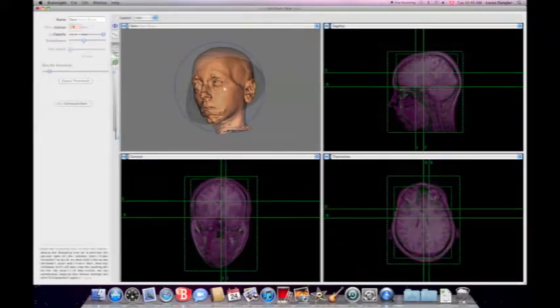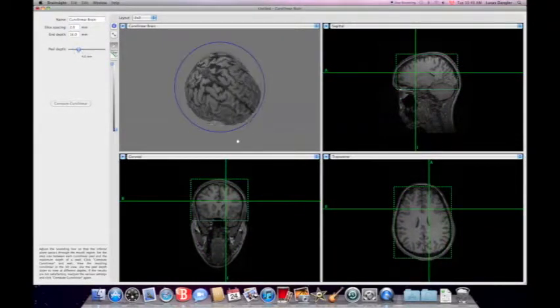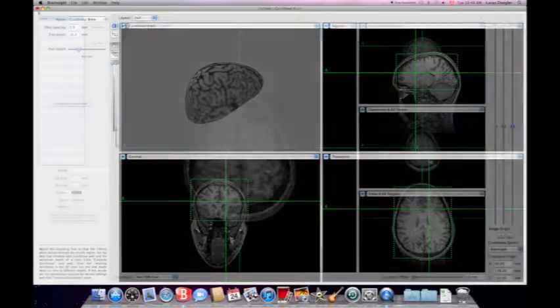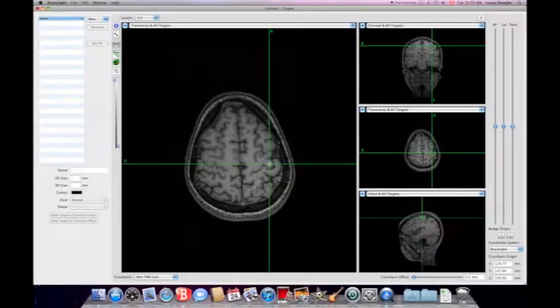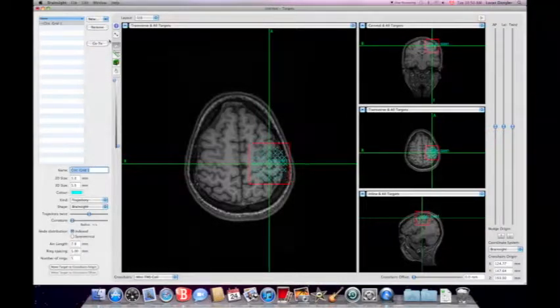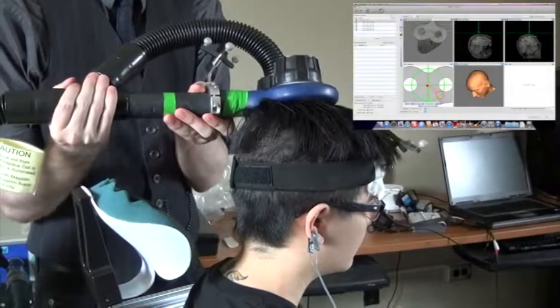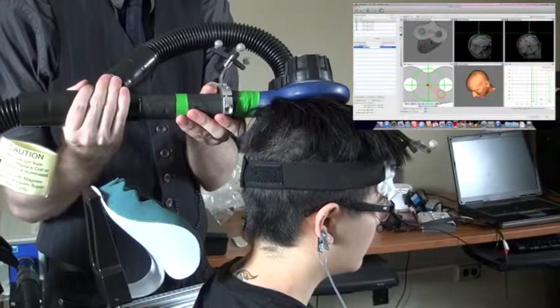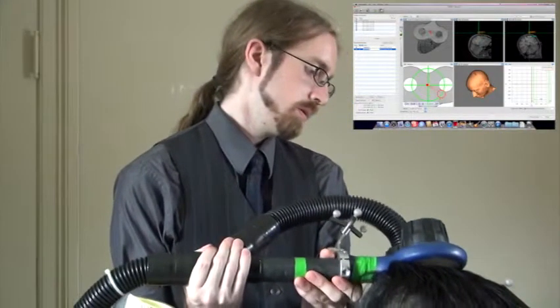TMS requires a detailed rendering of each participant's brain in order to accurately target stimulation to a specific brain area. We obtain an accurate picture by acquiring an anatomical MRI scan of each participant prior to the TMS procedure. The specialized software, such as Brainsight, is used to transform the MRI scan into a 3D representation of a participant's brain.